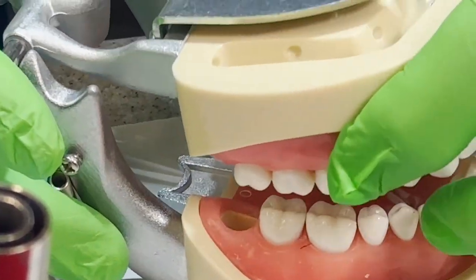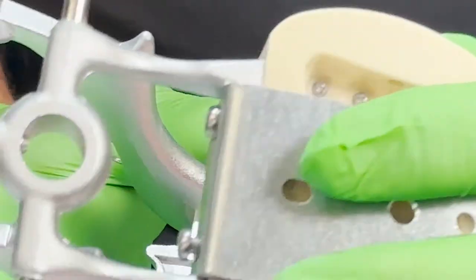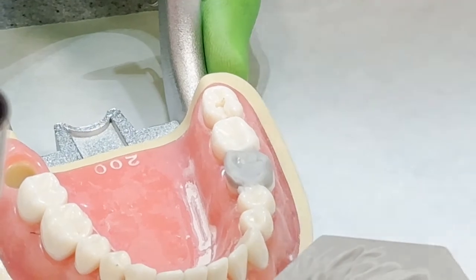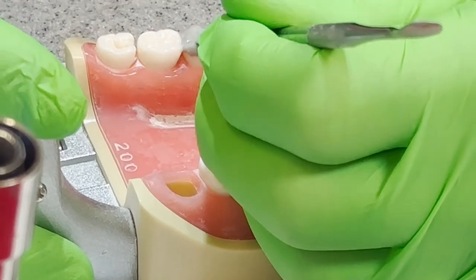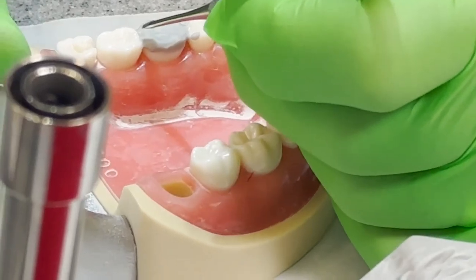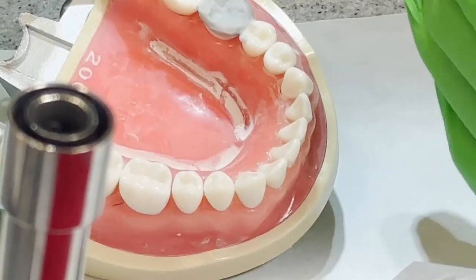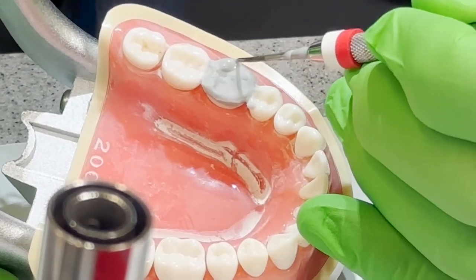Now, this will be the test of putting that together. This might be a little tricky because the contact here is on that incline that Dr. Janice said you don't want it to have. So I'm going to try to do the best I can with the ideal anatomy, but then you also have to deal with the contact, and that's where this exercise comes into play. We have to start recognizing that these teeth oppose other teeth.